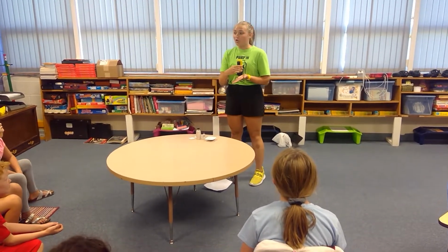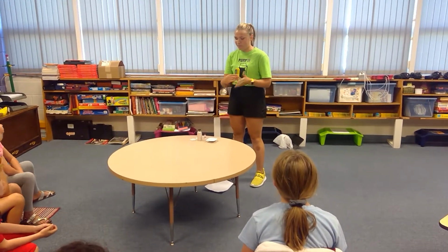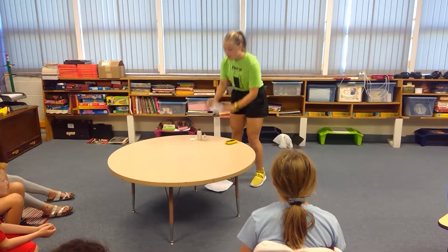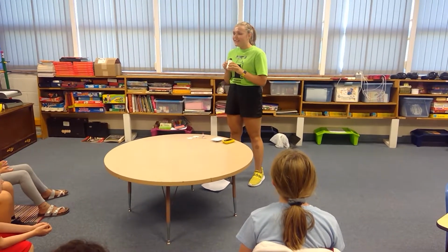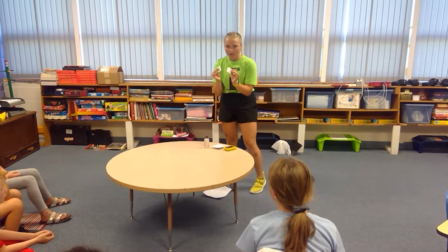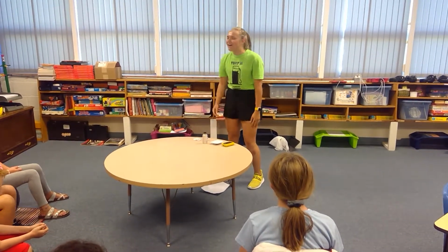First, I'm going to call something called a PDM, or a Personal Diabetes Manager. Second, we have a new sealed pod. Next, we have something called Skin Tack, which is like a sticky liquid that helps it stay on. And last, I'm going to use 2 alcohol wipes. And most importantly, I'm going to use something called insulin, which is what we're going to be putting into the pod.